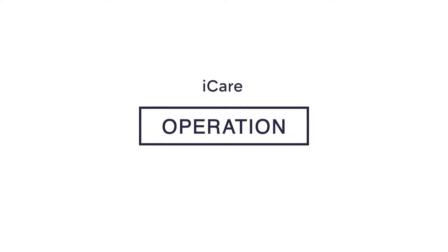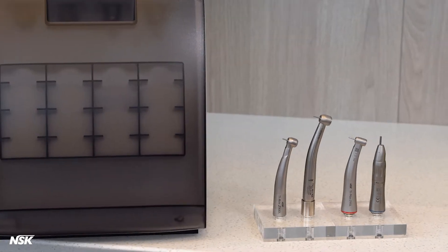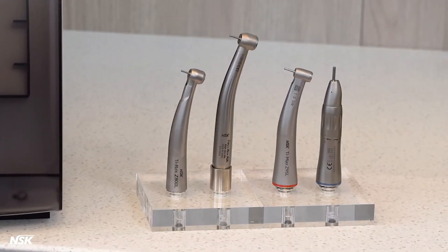NSK Eye Care operation. Now that your Eye Care is set up, it's time to lubricate your handpieces. For this demonstration, we will lubricate four handpieces.